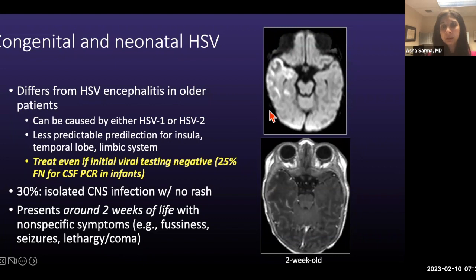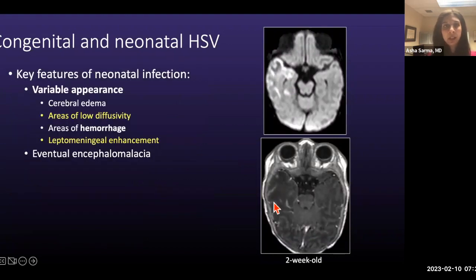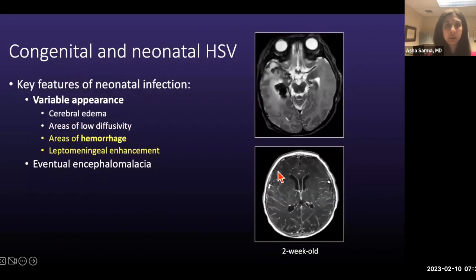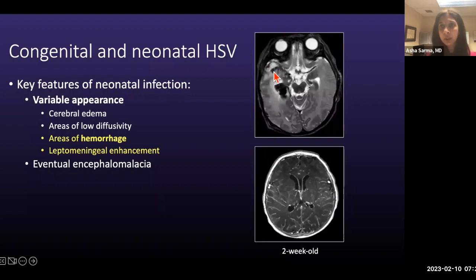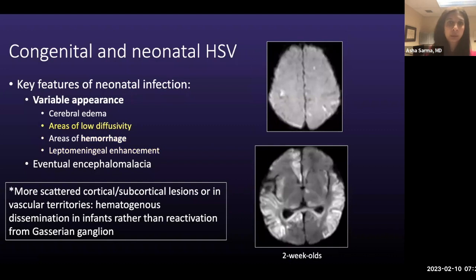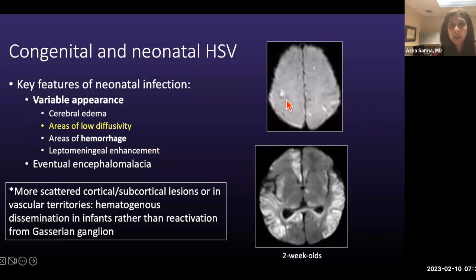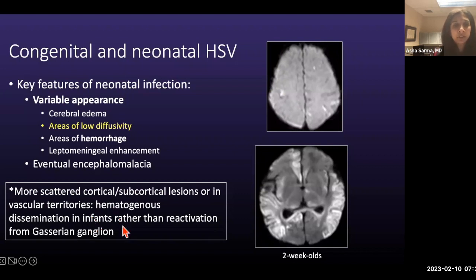Here is a patient with HSV infection showing abnormal low diffusivity within the anterior temporal lobe and some leptomeningeal enhancement — this area may eventually become encephalomalacia. Areas of hemorrhage are very common in neonatal HSV infection. Here a patient has a big T2 hypointense hemorrhage with lots of edema, more hemorrhage anteriorly within the temporal lobe, and leptomeningeal enhancement. Importantly, you can have more scattered lesions — little nonspecific-looking areas of low diffusivity or lesions in vascular territories — because transmission is hematogenous in infants rather than reactivation from the Gasserian ganglion.